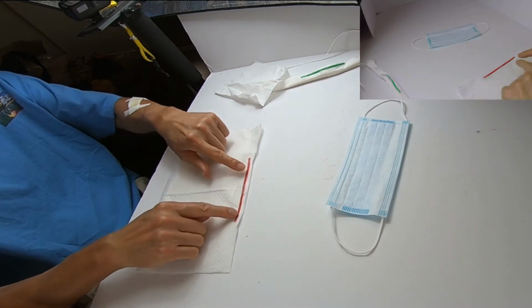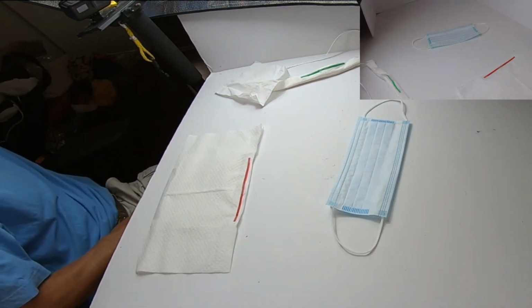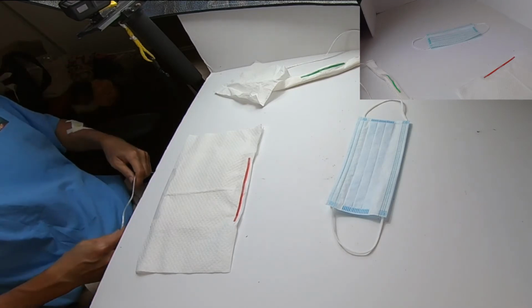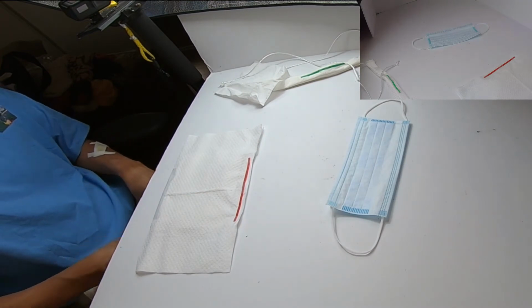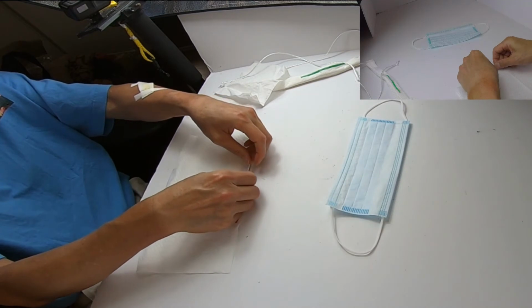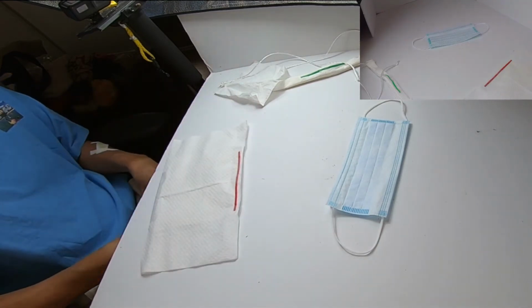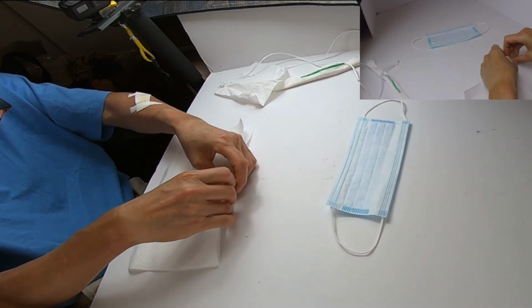So now you've tacked down the sides of the ties. And now I'm going to add a little bit more tape to the in-between spots, just to make sure that this is tacked on well.